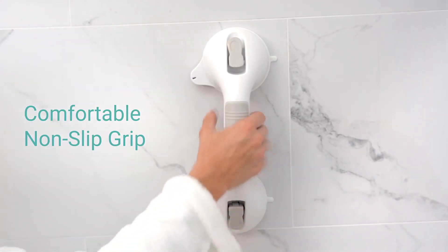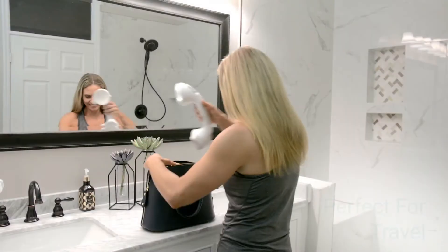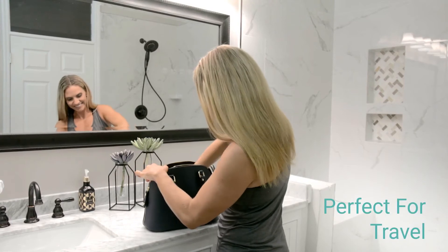A contoured, textured rubber handle provides a comfortable, non-slip grip. Take it with you when traveling for a safe bath or shower anywhere.